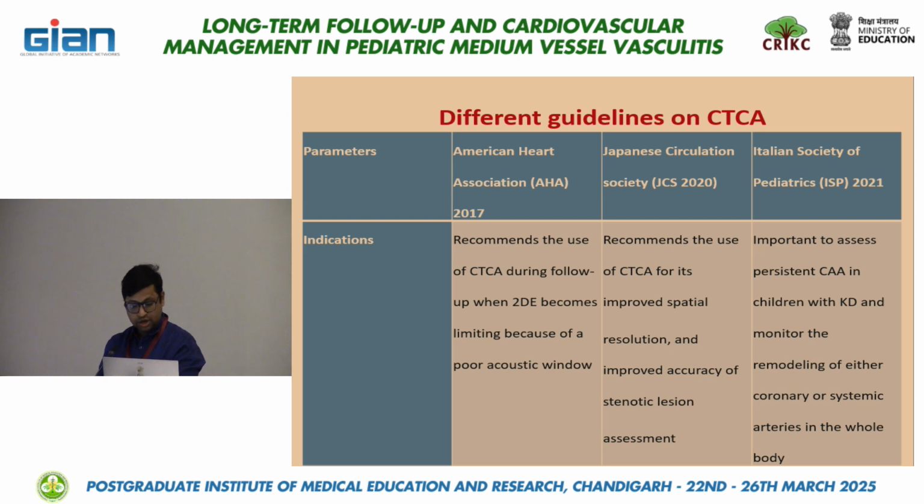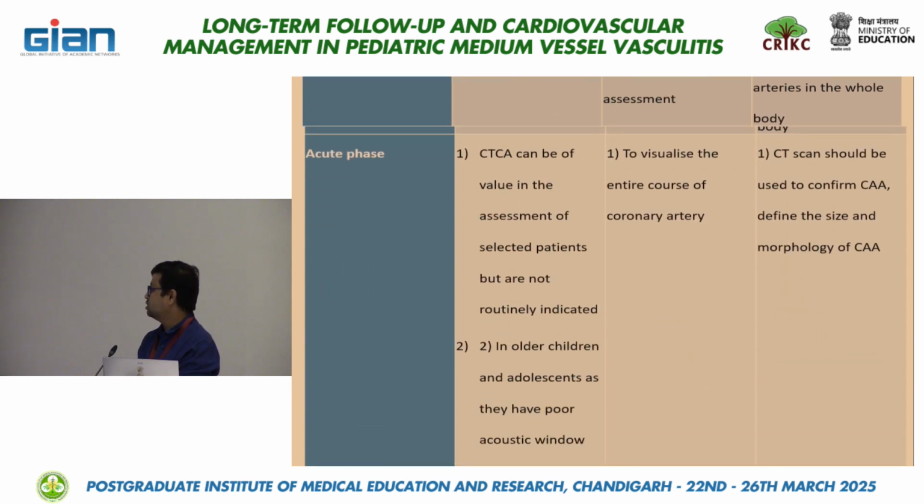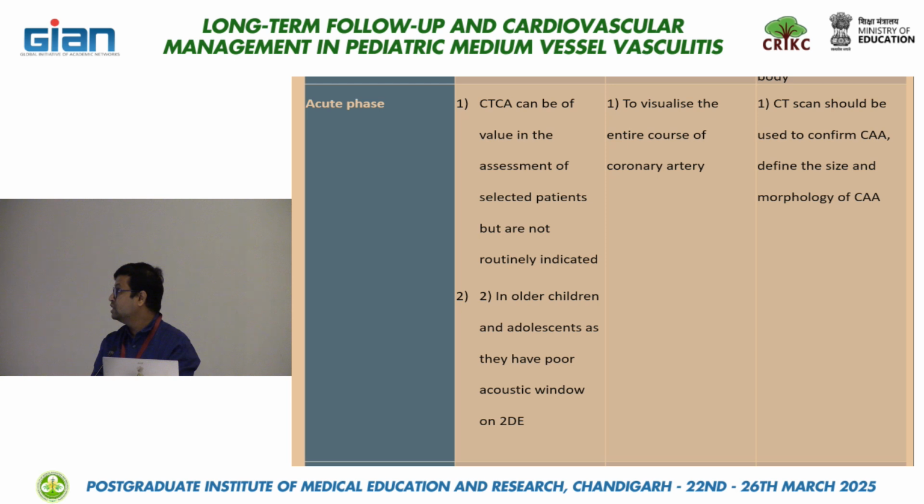And the Japanese Society has also suggested CTCA for the changes in the follow-up period, both Italian Society and Japanese Society. And in the acute phase in 2017, they said there was one line that CTCA can be of value in the assessment of selected patients but is not routinely indicated. And the same thing, the older children.